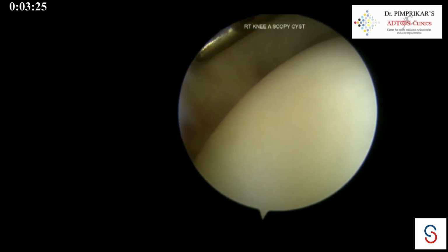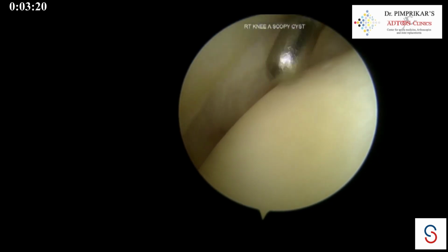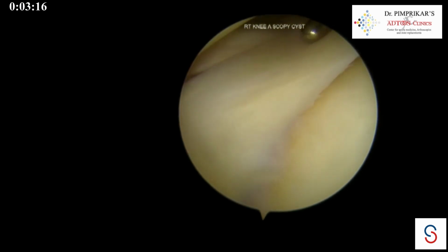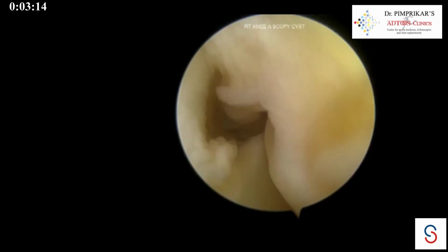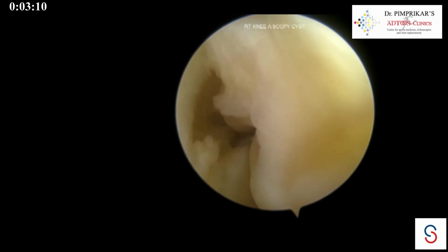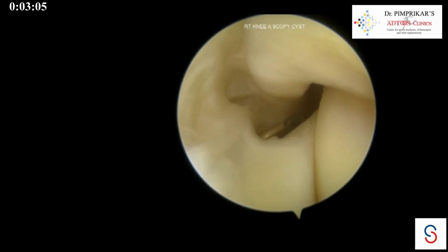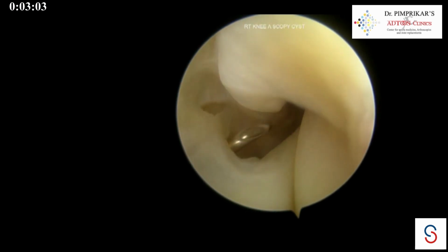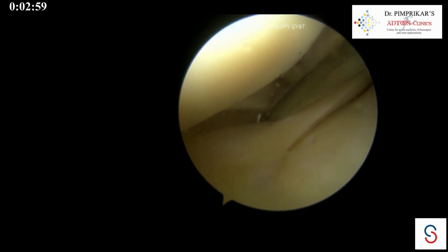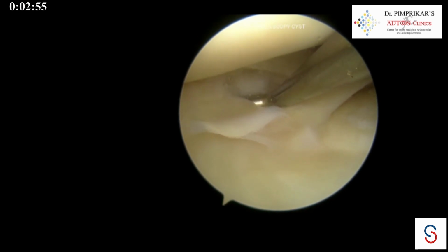That's the popliteus tendon. That's the inferior fascicle there, and we tried to probe that to look for injury. The suction test was positive. The meniscus was hypermobile here. So we inserted a needle through the cyst and took the path of least resistance to find where it exits. We found in the lateral gutter that it came out of the popliteal hiatus there. If the needle passes through with the least resistance, we thought probably this is arising from the lateral meniscus and inferior fascicle.